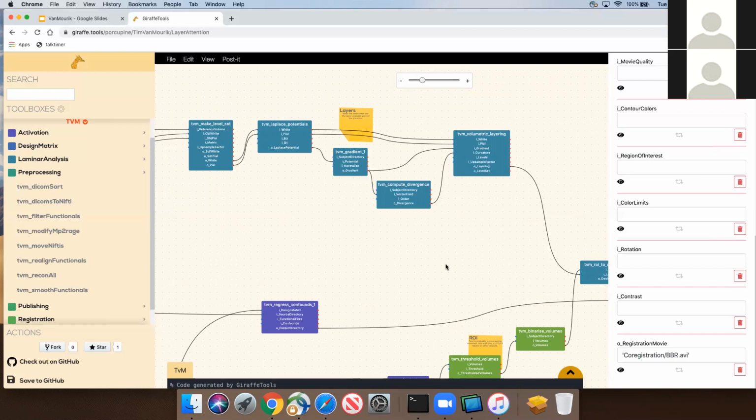And there are different ways of drawing intermediate surfaces. And one of them was, according to the equivolume principle, the idea that if you're in the inner curve, the thickness expands a little bit, and when you're in the outer ring, it shrinks a little bit, like this.